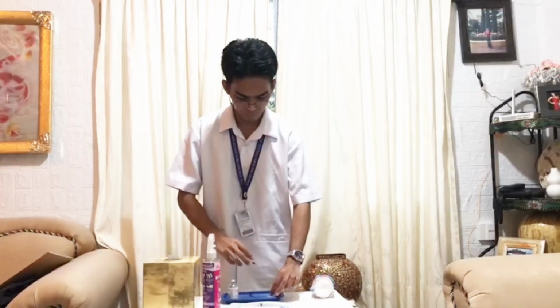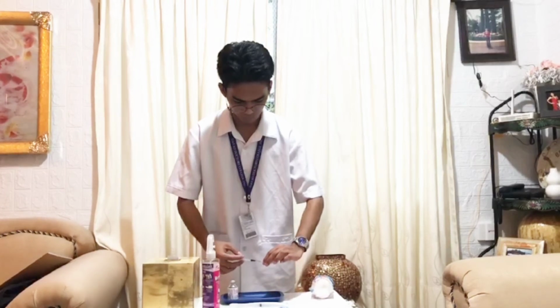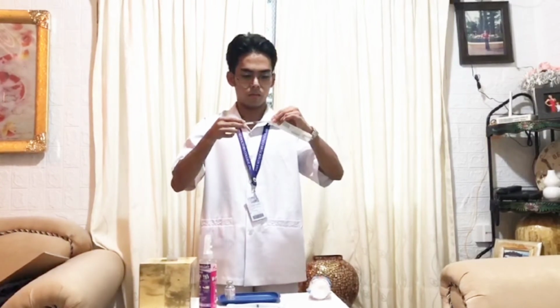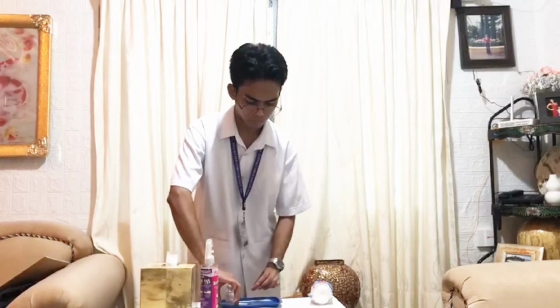Now I am going to insert the aspirating needle. Make sure that the connection isn't loose. Now I am done inserting the aspirating needle. So now I am going to write the medication ticket, so we won't forget what medication it is, the dosage, and of course for whom it is.